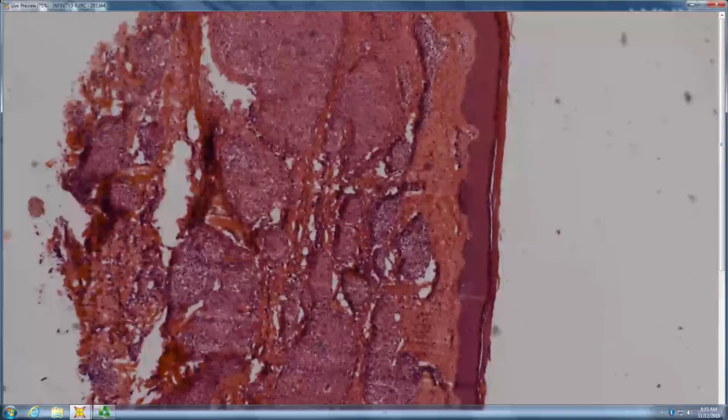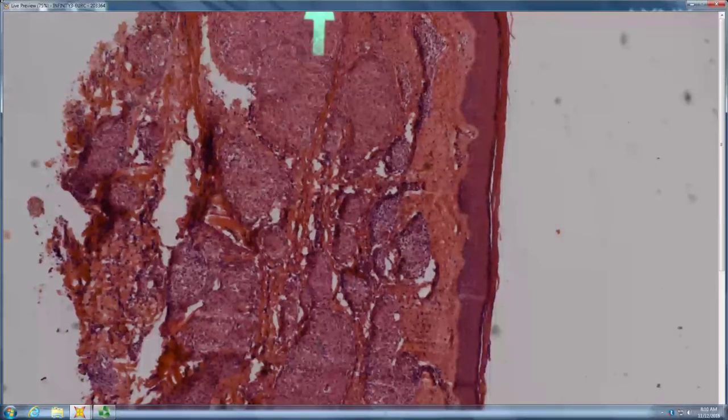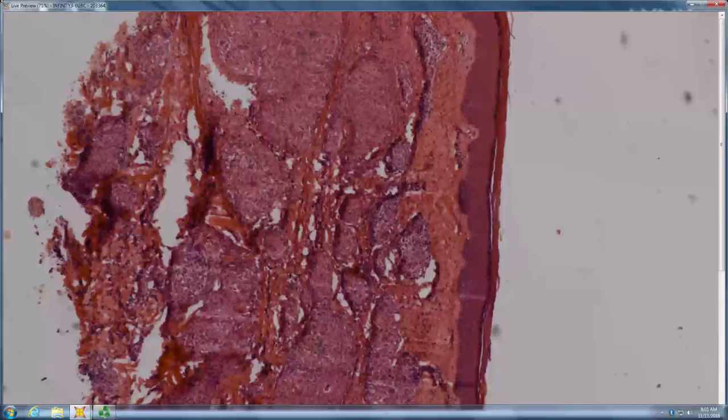Lots of nodules of cells. What kind of cells? Looks maybe histiocytic from this. Yeah. Do you see collagen between them, or is it just cytoplasm up against cytoplasm forming a nodule? So just granulomas. Granulomas, and are they particularly dressed, or are they more naked? They're pretty naked. Sarcoid, other naked granulomas. So tell me about other naked granulomas. You could have Crohn's, silica, granulomatous cheilitis. Zirconium, beryllium.